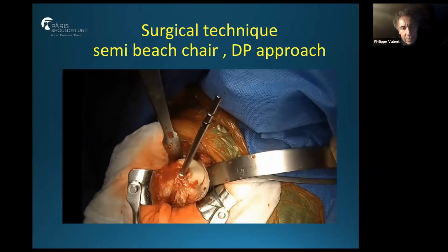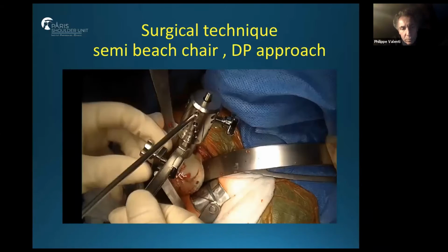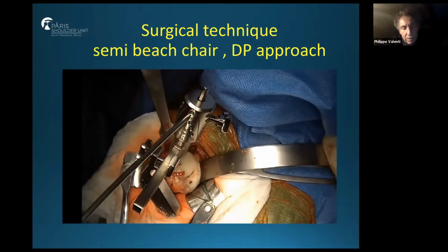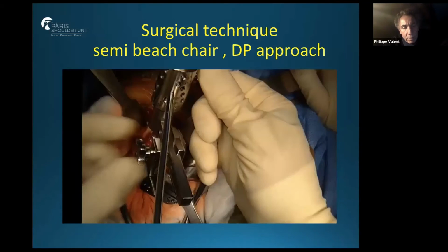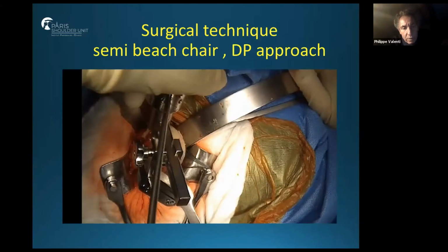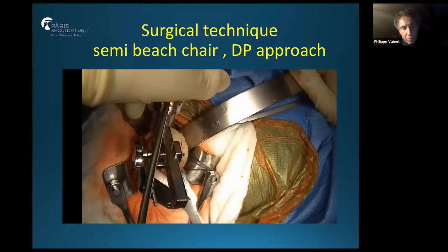There we use a guide because I think it's very useful to determine the retroversion, with a good alignment between the rod and the forearm. For the level of the cut, this is an onlay system. We have to remove a little more bone than with an inlay system. And we use a pin at the superior part, which is flush to the greater tuberosity.